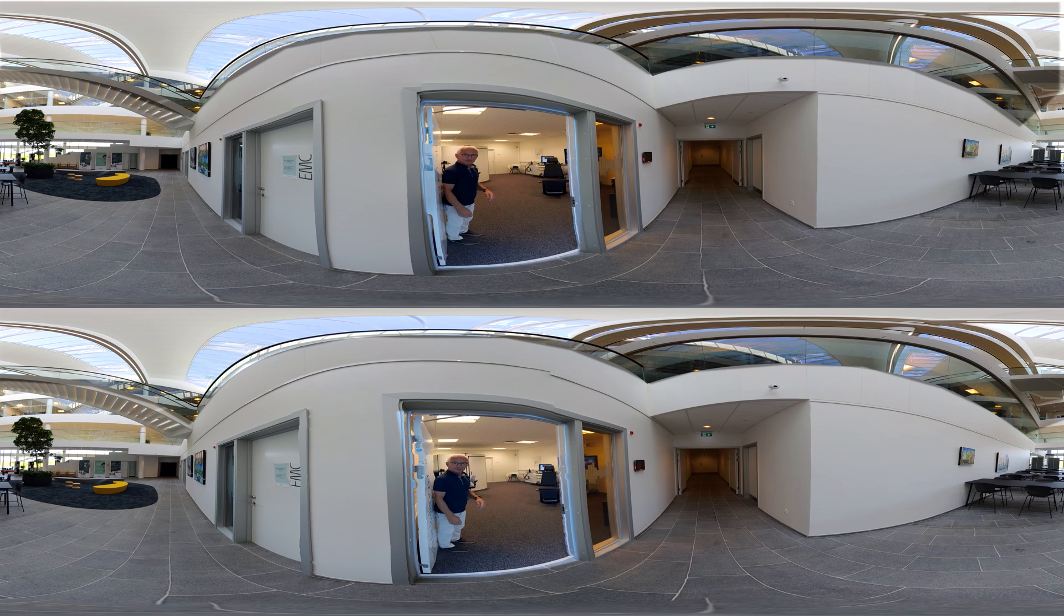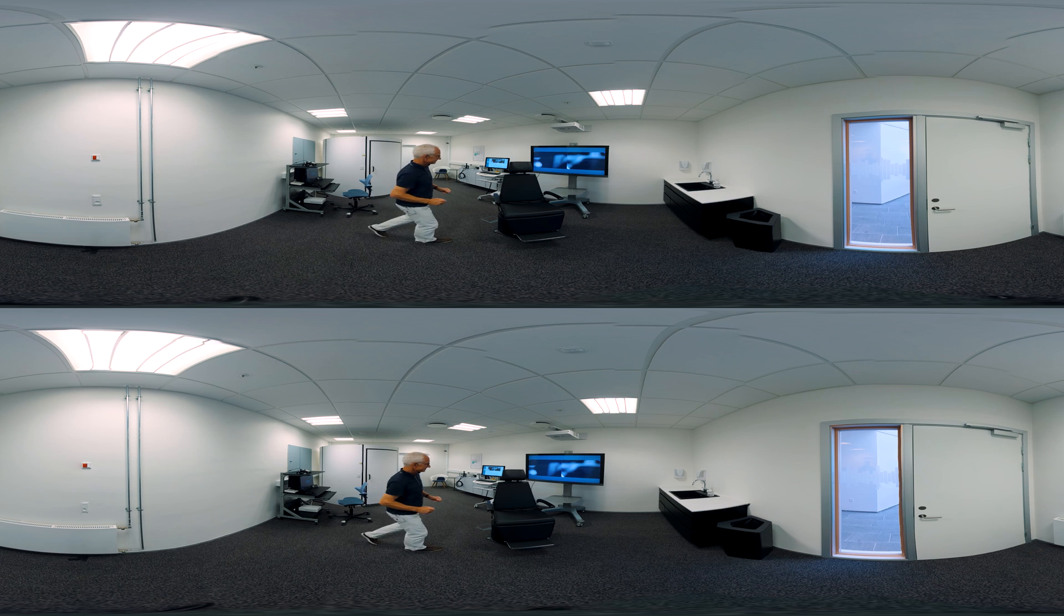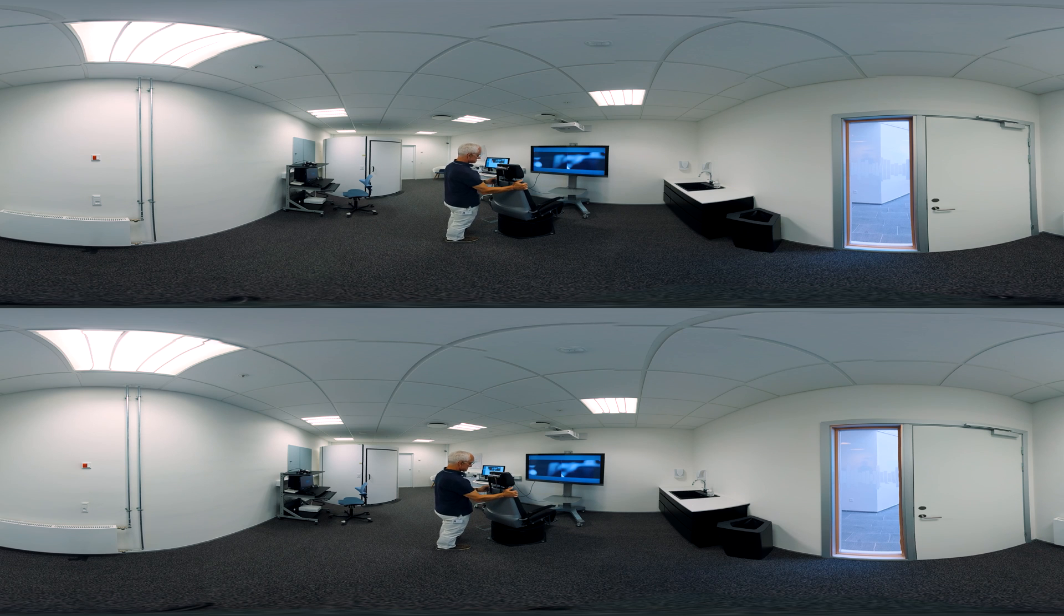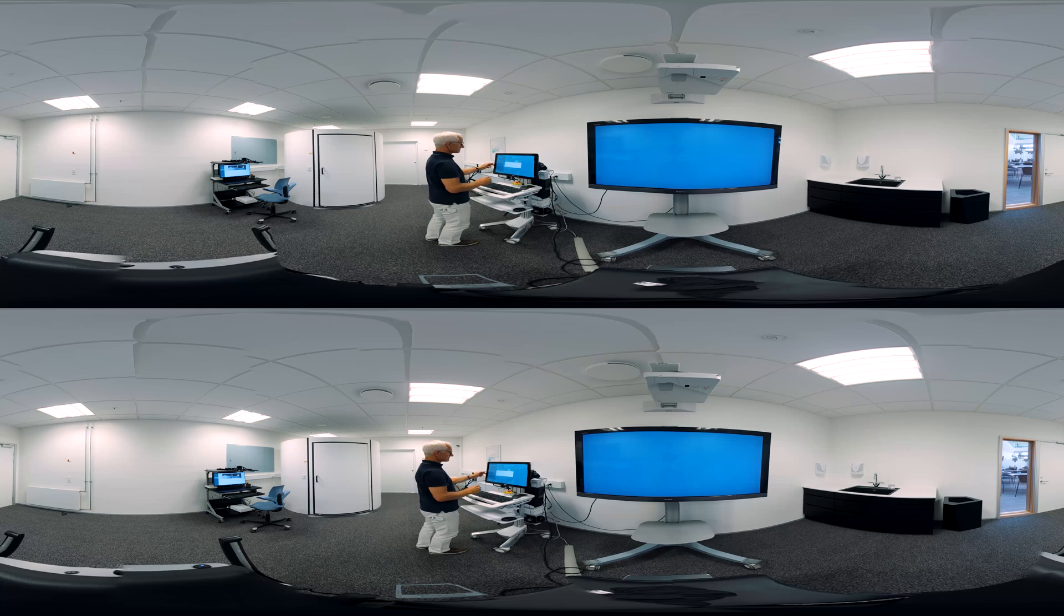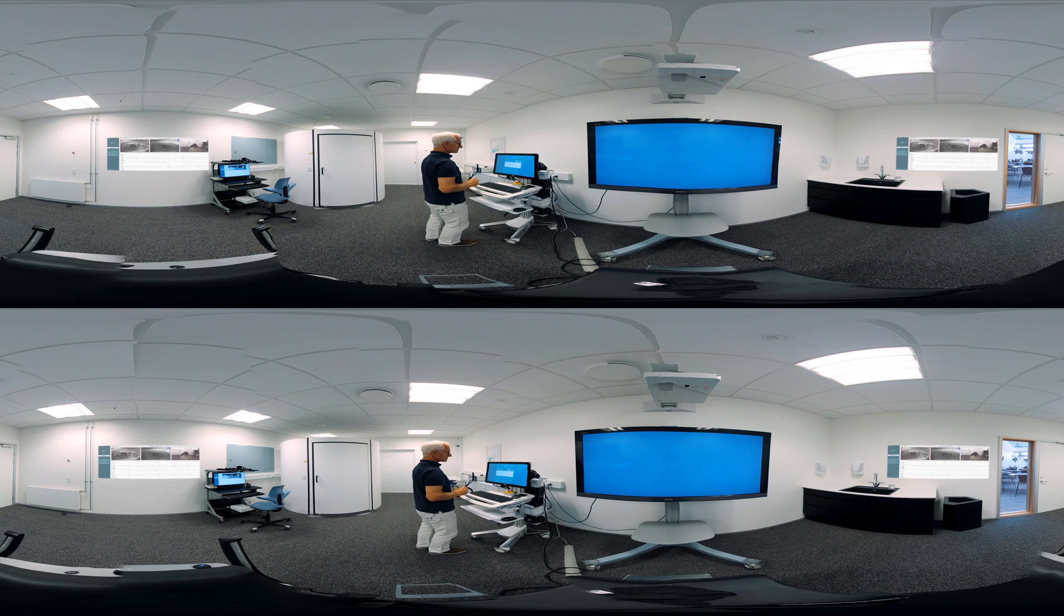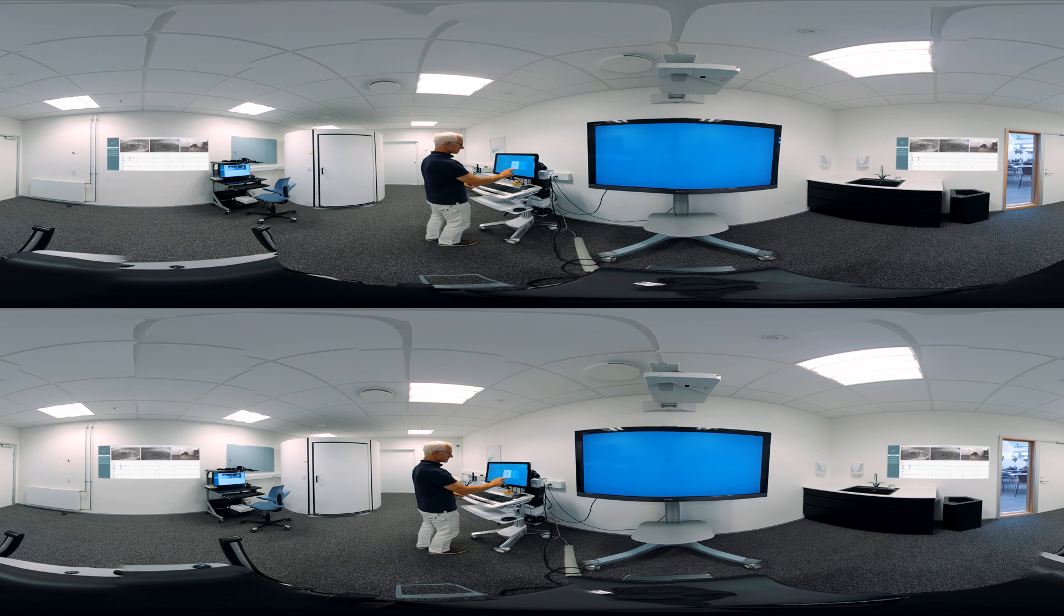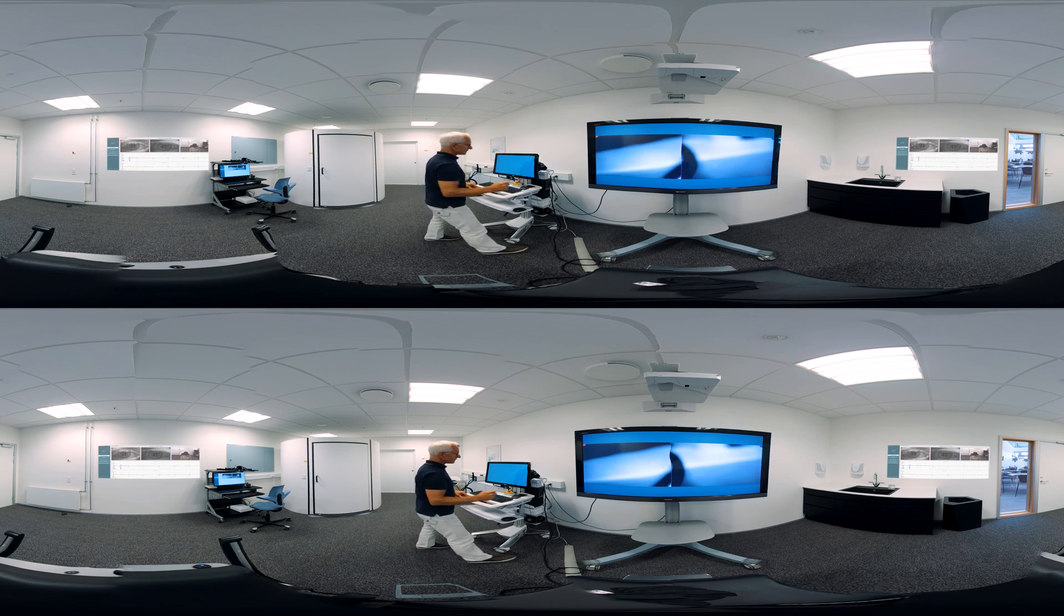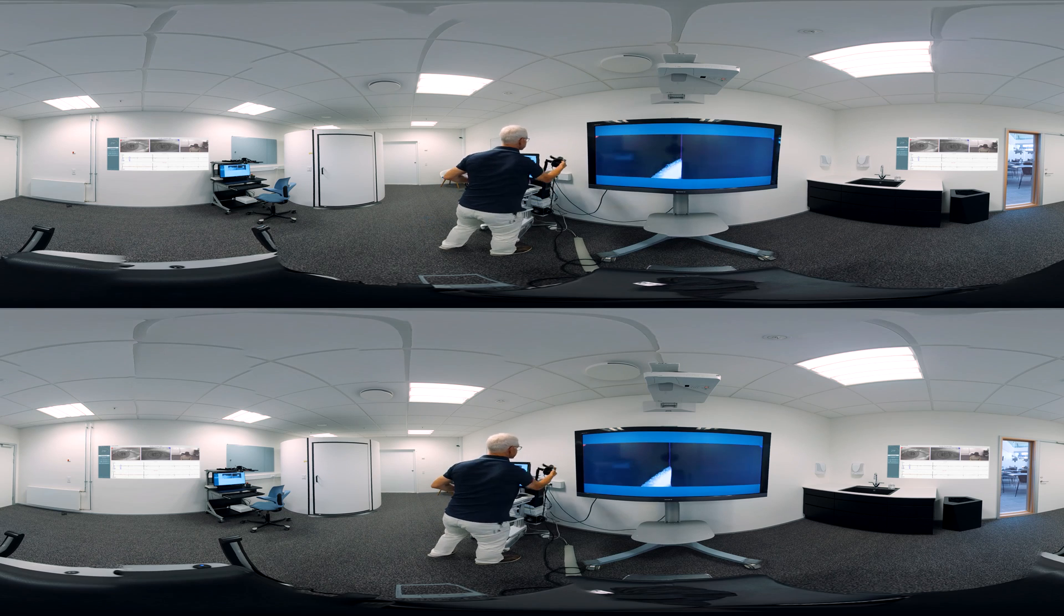This is where we test and demonstrate our balance solutions. Please take a seat in the rotary chair. Now look around. Visualize is everything you see around you and more. It is a software platform offering video nystagmography and video head impulse testing and tests using rotary chairs like the one you are sitting on now.